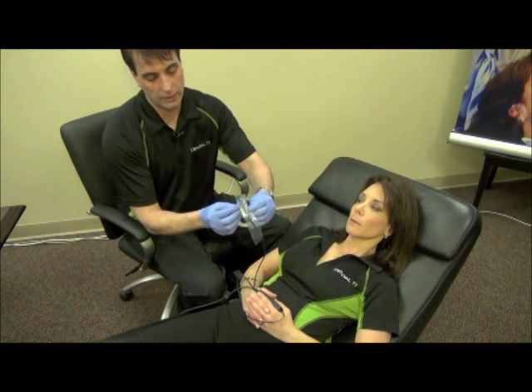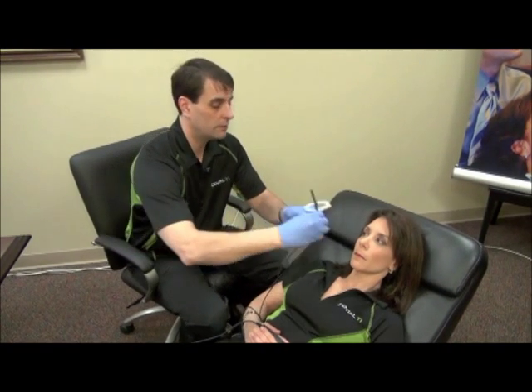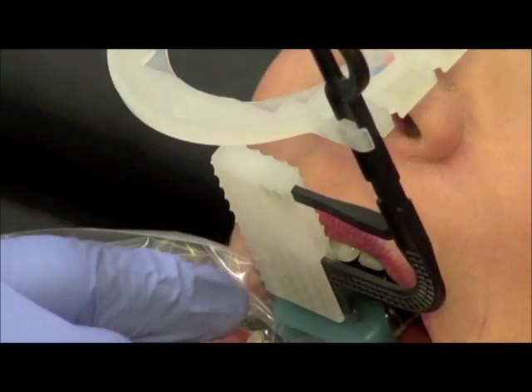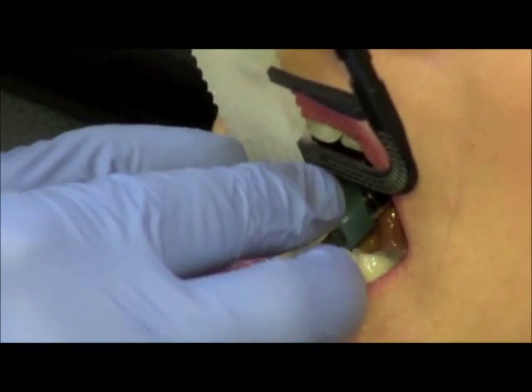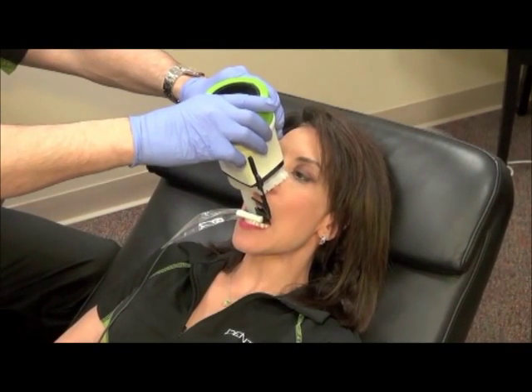Here we've got a number one sensor covered and ready to go for an anterior shot. I typically recommend the smaller sensors if you're just taking one or two teeth in the anterior region because it's far easier to place. We're going to go in at a 45-degree angle. I pull the cord to the side, press the bite block against the upper incisal edge, and have the patient close down. They're actually able to stabilize the sensor holder between the lower premolars. If they were having a difficult time, again we could use the cotton roll. When you're taking the x-ray, the x-ray tube needs to be flush with the alignment ring, and then we will pick up apices to incisal edge.